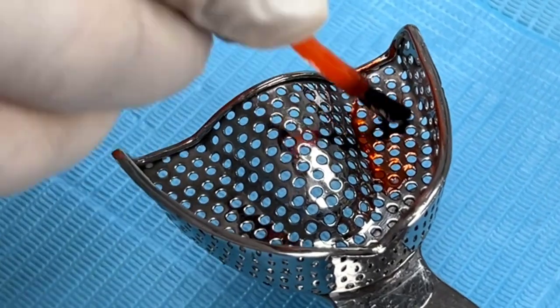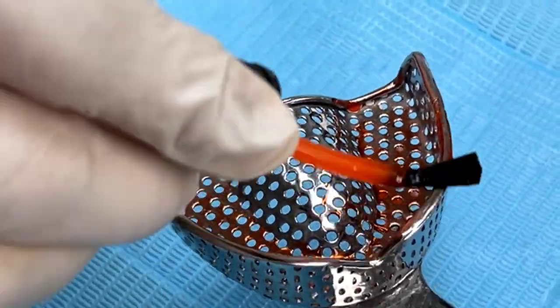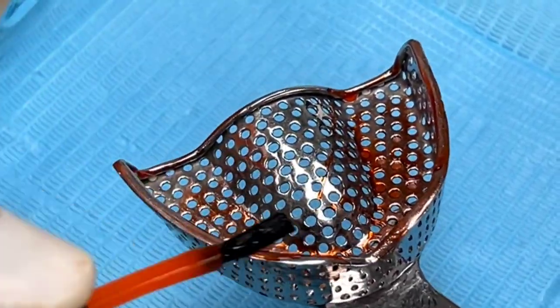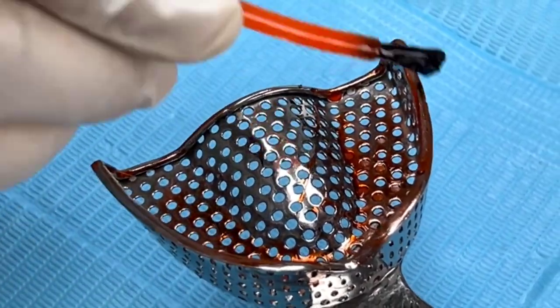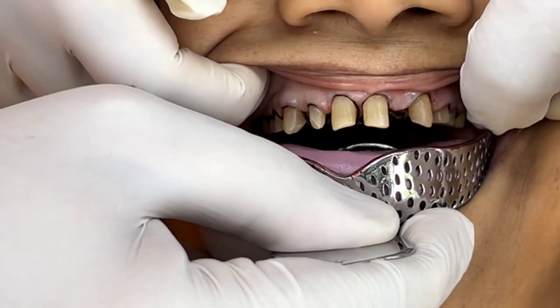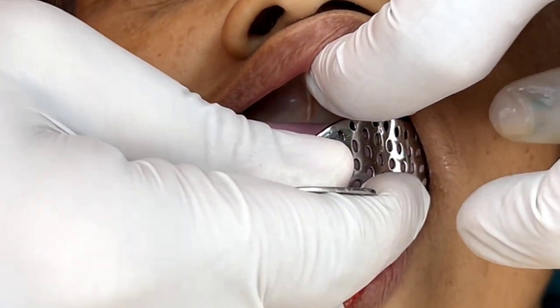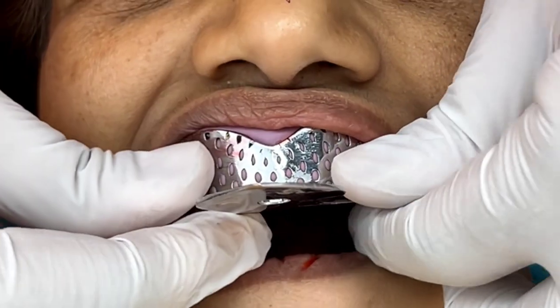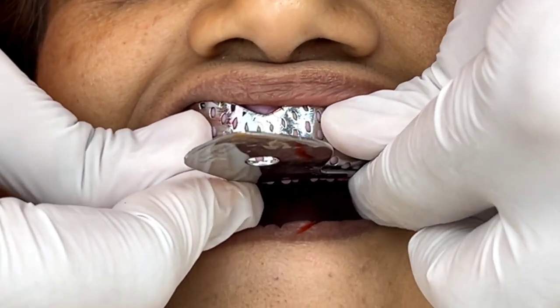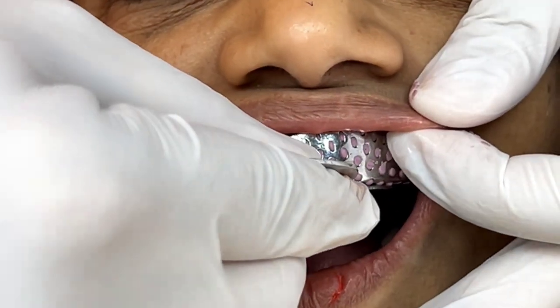In this video I explain the use of addition silicone to record a modified two-step impression technique for a full mouth reconstruction case. We start with a metal stock tray and tray adhesive. Next, putty is mixed and loaded into the tray, with the tray inserted into the patient's mouth without any foil or separator.